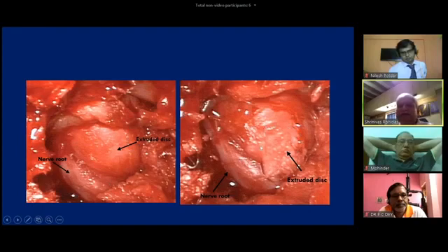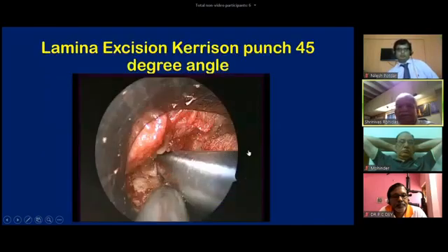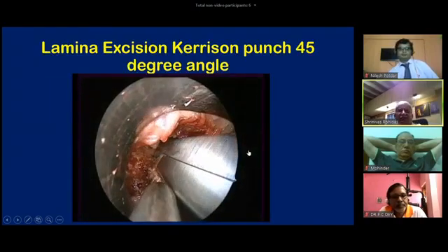The foraminal discs are quite few in Indian people. In European people, it is something around 8 to 10% they found the foraminal disc. Now this is the decompressed exiting root. Medial to the traversing, the exiting root is the disc. This is one of the representative cases.